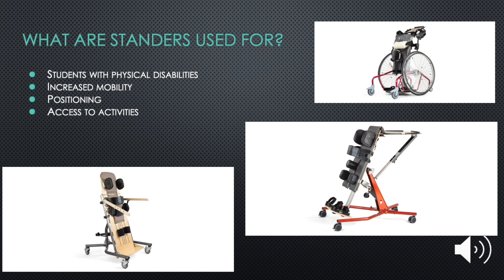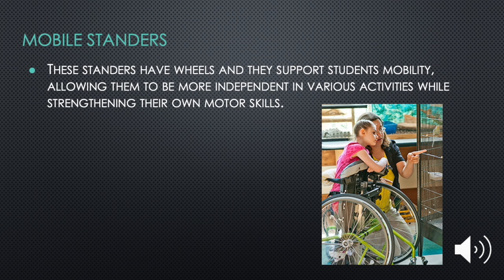And these standers are used for students with physical disabilities. They increase students' mobility, provide positioning, and they also provide access to activities for students that normally wouldn't be able to necessarily walk around freely on their own or bear weight on their own. Mobile standers have wheels and they support students' mobility, allowing them to be more independent in various activities while strengthening their own motor skills.